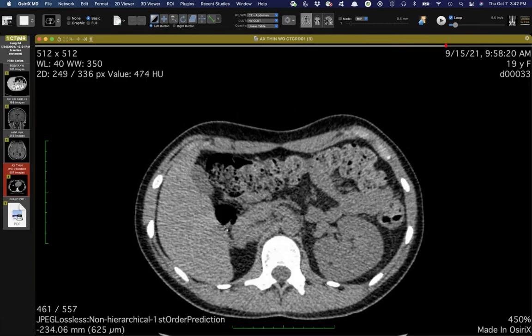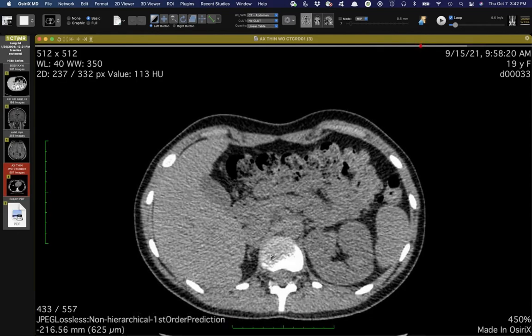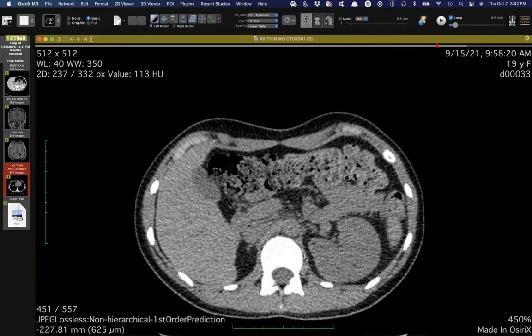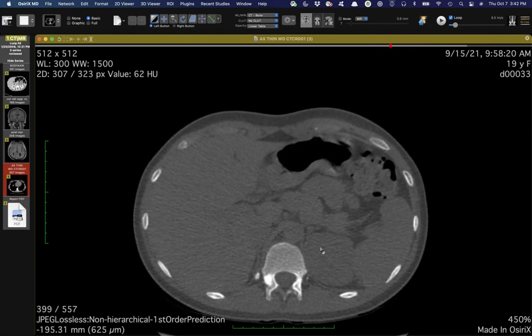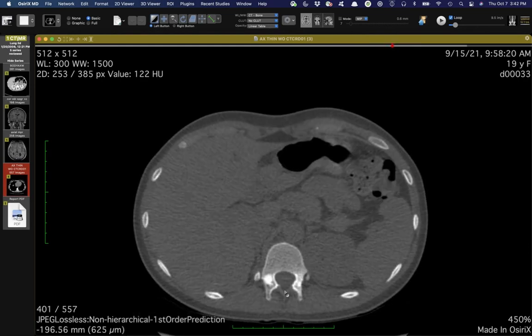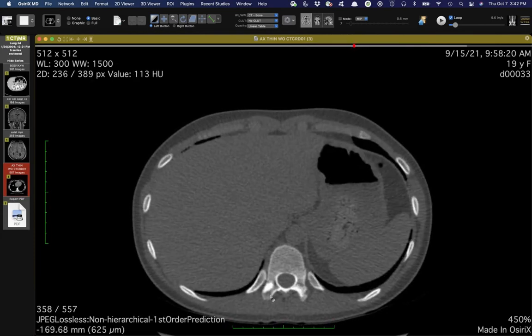And then you can see her right kidney is notably absent. She had a nephrectomy at age 10 or 11. She's probably got a couple small AMLs in her left kidney. I've shown this before too, but this is the other one, and this is as good of an example as I've seen. Especially if you're helping to distinguish LAM from tuberous sclerosis complex, look for the sclerotic bone lesions.